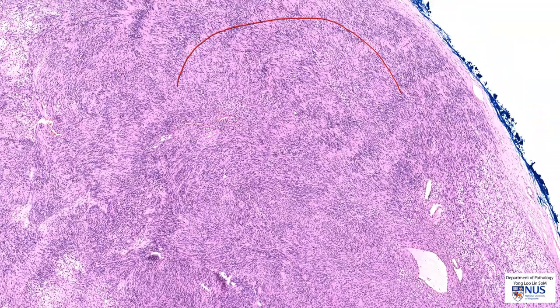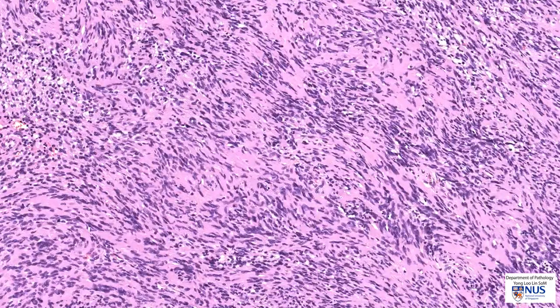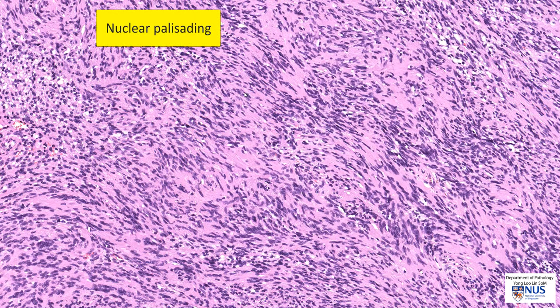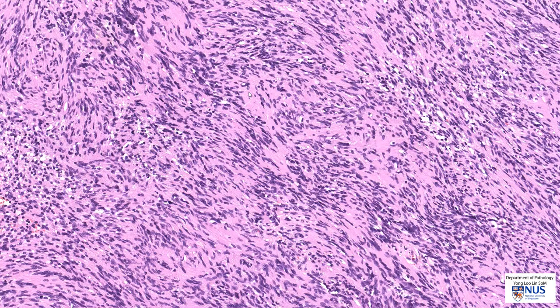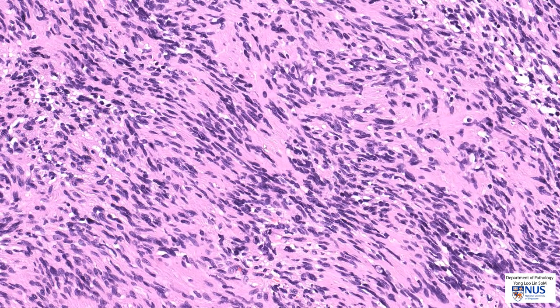In some areas, you'll notice that the nuclei tend to line up, and this is known as nuclear palisading. Here again, the nuclei are lining up. When we see several nuclear palisades — one row here and another row here — separated by fibrillary pinkish material, this is known as a Verocay body.